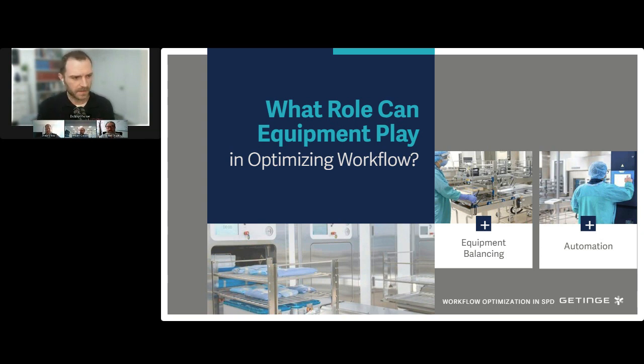That sounds like experience and wisdom talking, Steve. And I like that. What you said with both of those points was essentially, let's start by looking at the end, like what are we actually trying to accomplish, and making sure that our solutions, both in our automation and our equipment selection, actually meet that need. And I think that's really wise, instead of just going after particular features and then discovering, oh no, now we've got to manually wash all these instruments, or maybe we've got to get a carriage that only has one level in it so that we can have enough room to have the clearance to fit this big piece of equipment in, and there goes all of our efficiency gains.